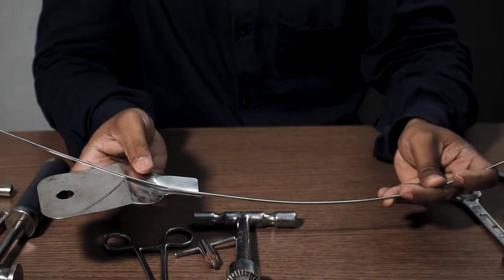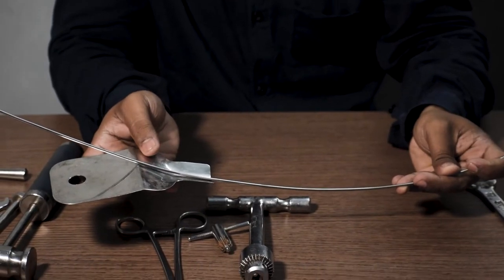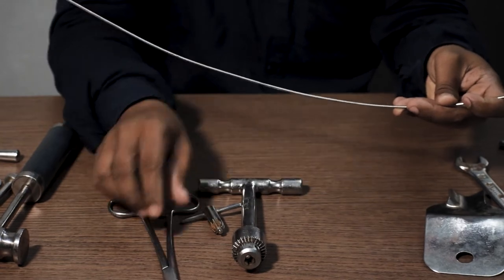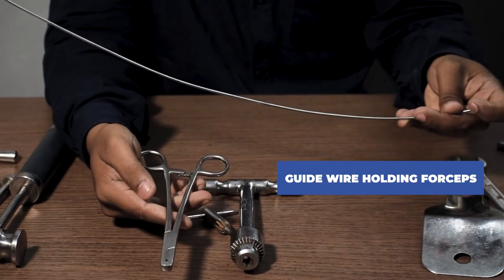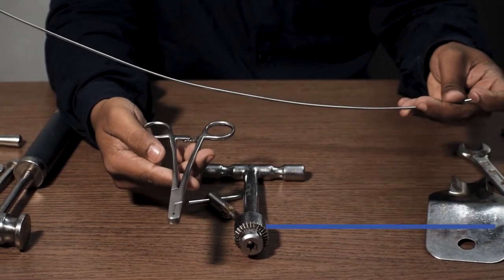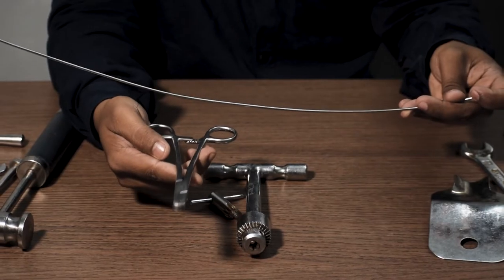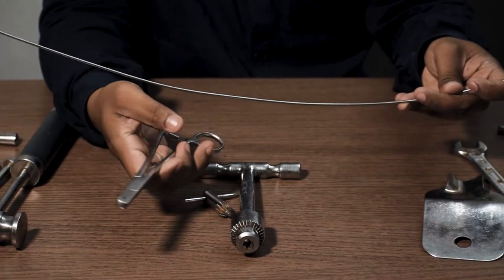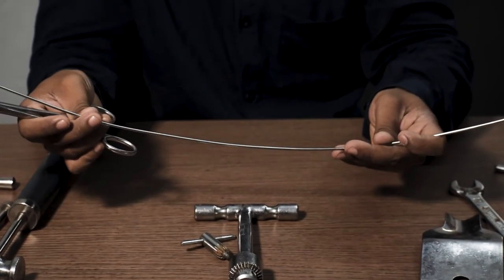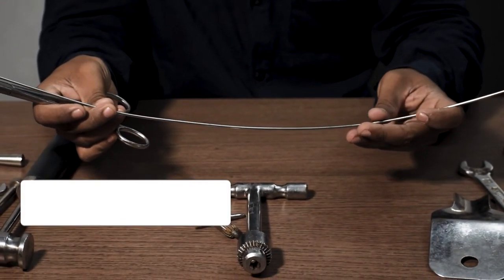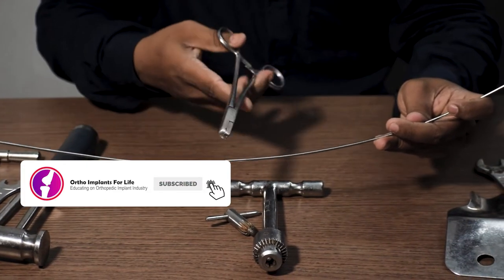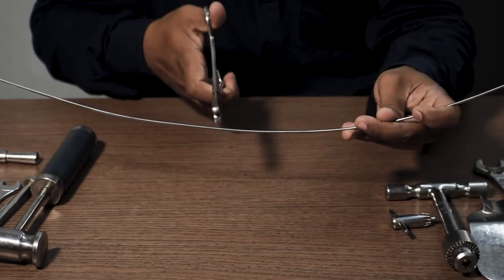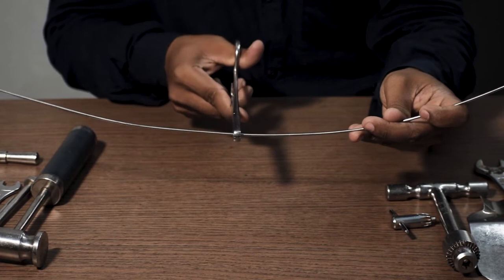This device is called a guide wire holding forceps. While using flexible reamer, when the flexible reamer is being taken out, there is a chance of the guide wire being pulled out with it as well from the medullary canal. That's when we use the guide wire holding forceps to hold the guide wire in place like this.